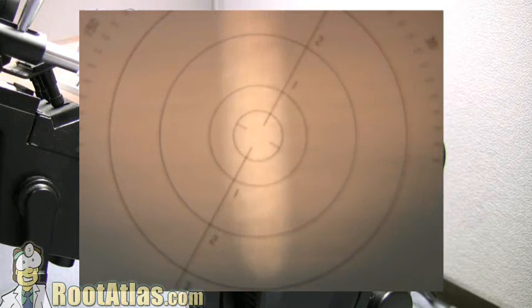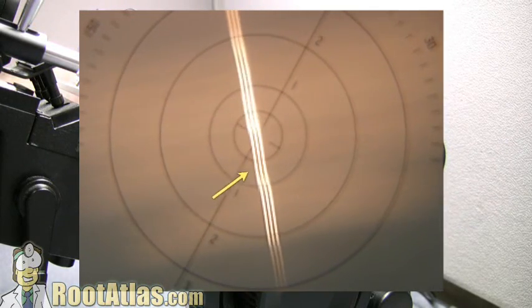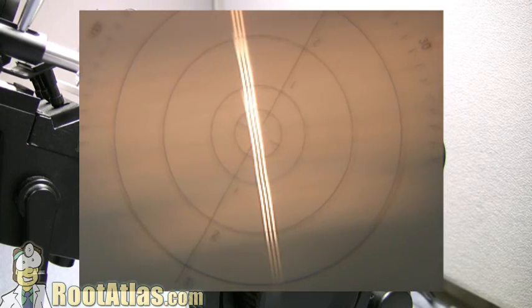So if we zoom in, we can see there are three lines. You want to get them lined up and in focus, and then you can mark down what this is.